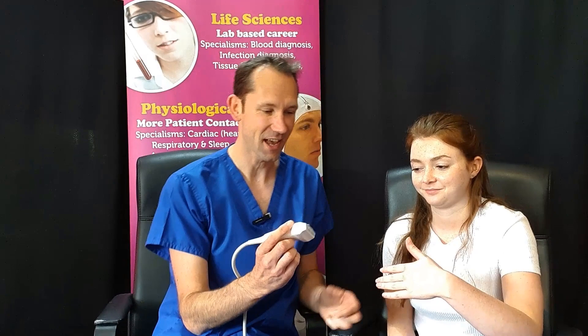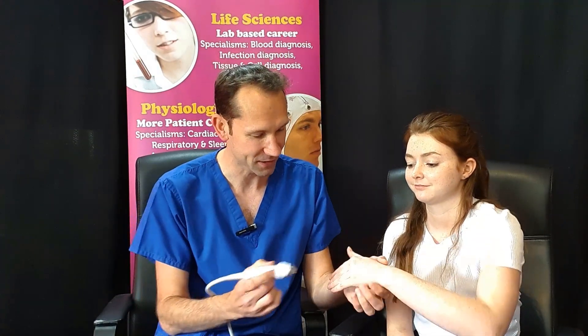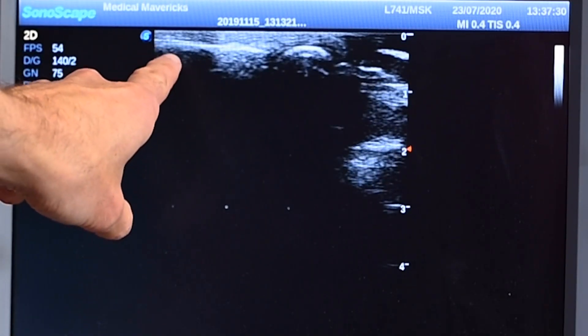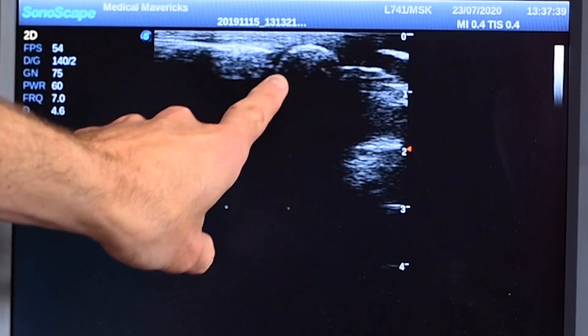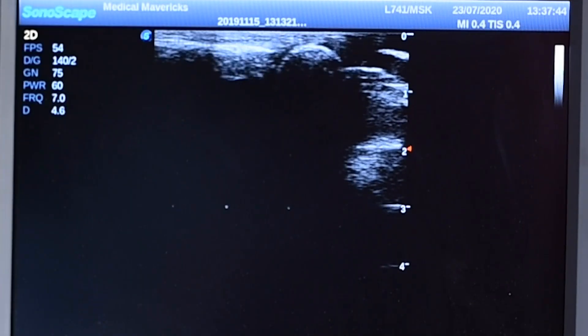Let's crack on — literally! We're going to pop the ultrasound probe onto Lizzie's knuckles like this. Look out on the screen. We're going with the index finger first. On the screen, this is the finger bone and this is the knuckle joint just here. We're looking in this gap — the bone comes across the gap, and this is the head of the bone in the hand.